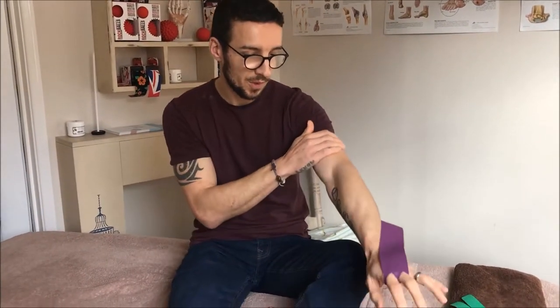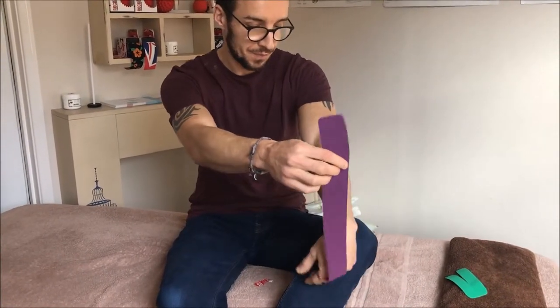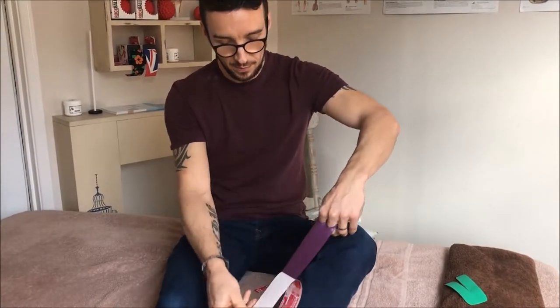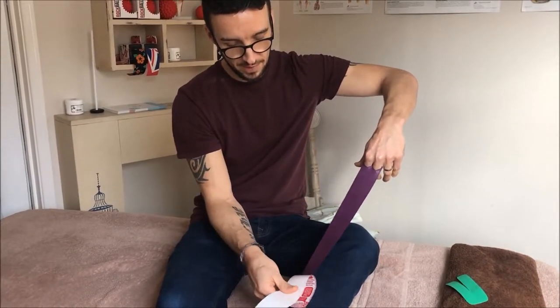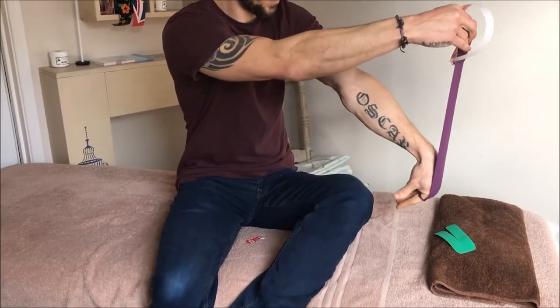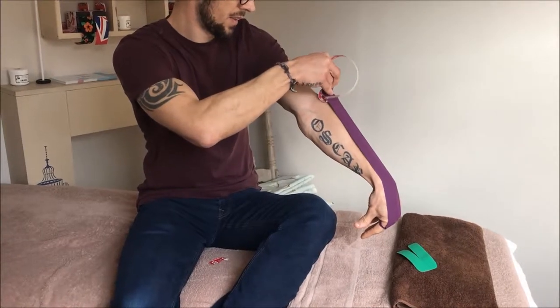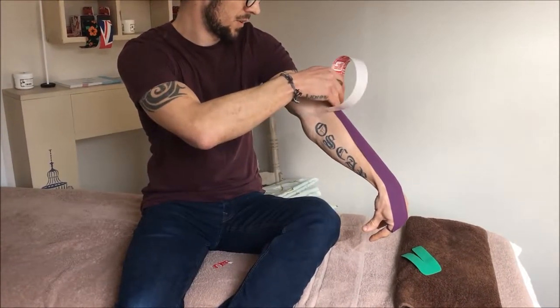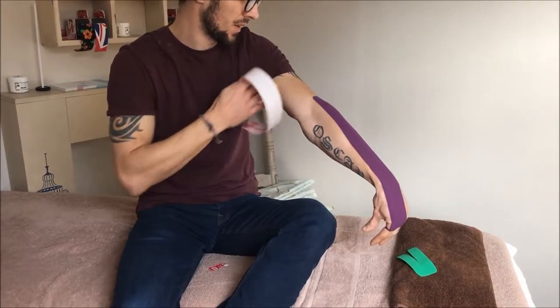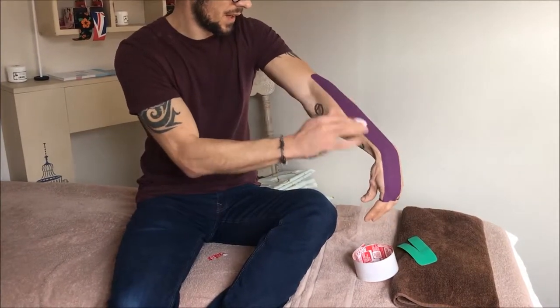The position we want is to flex the wrist. Take the tape, give it a little tug to break the backing, and move the backing all the way up, leaving about an inch at the end. Apply the tape over the wrist and up the forearm heading towards the lateral epicondyle, applying little to no stretch as we go. Then activate the glue.